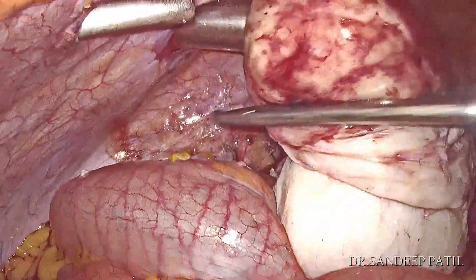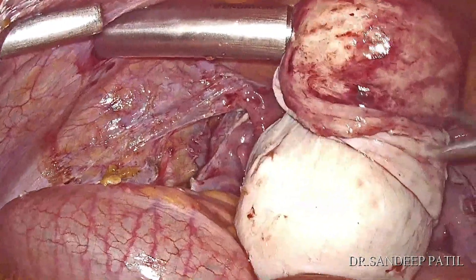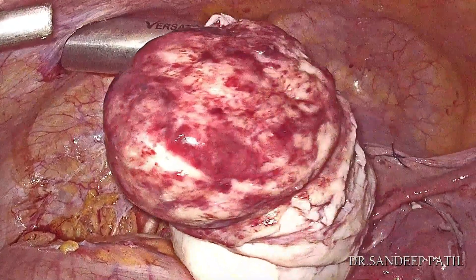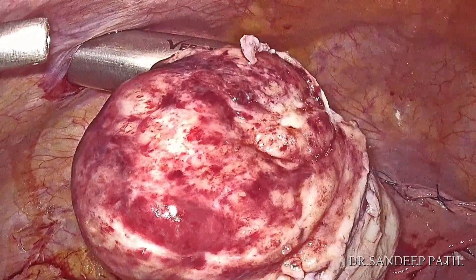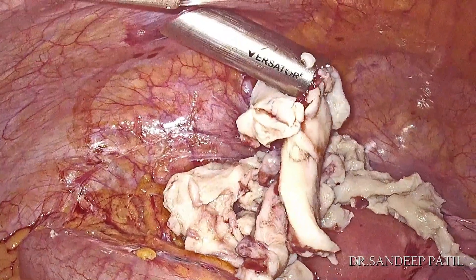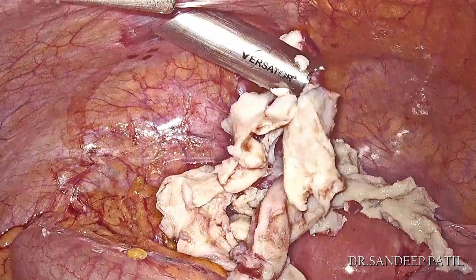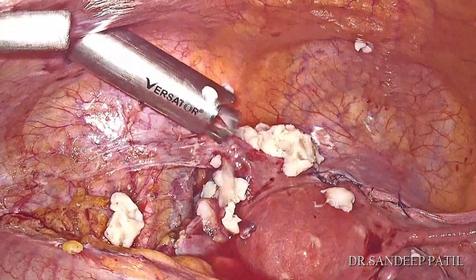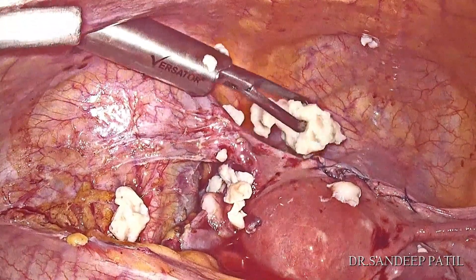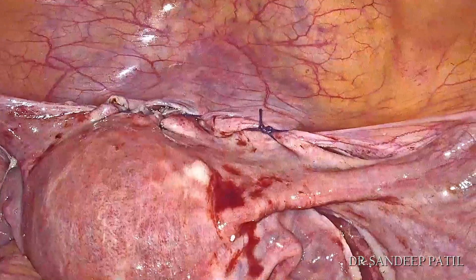The last step of the surgery is tissue retrieval which is done by morcellation. Here we have done naked morcellation. However, contained morcellation is a better option, as it avoids spillage of macro and microparticles of fibroids and reduces chances of parasitic fibroids in future.